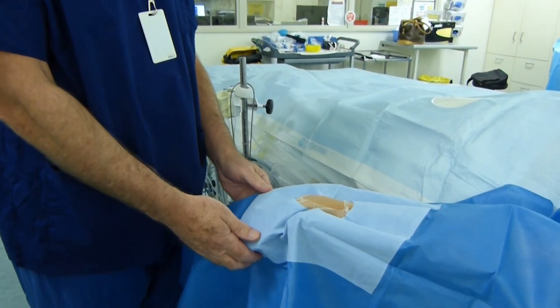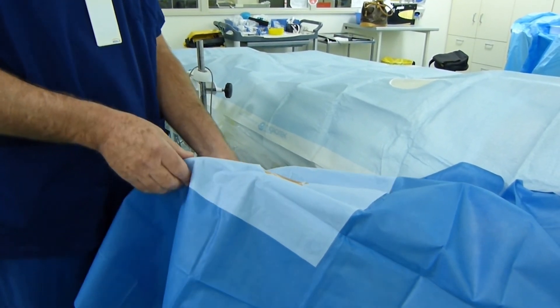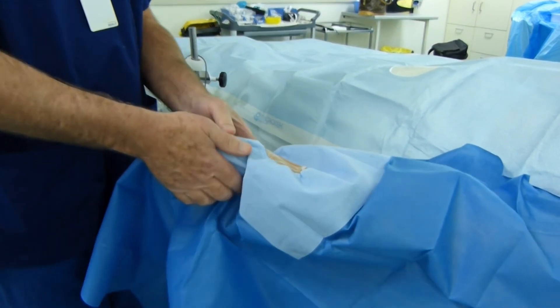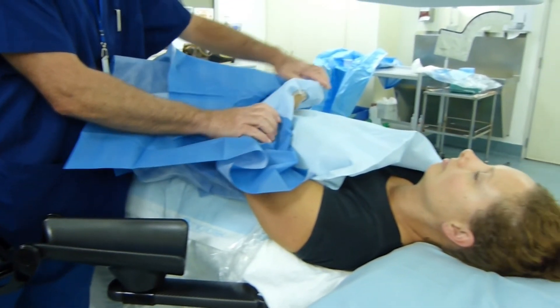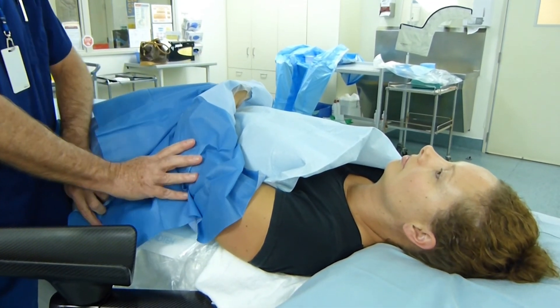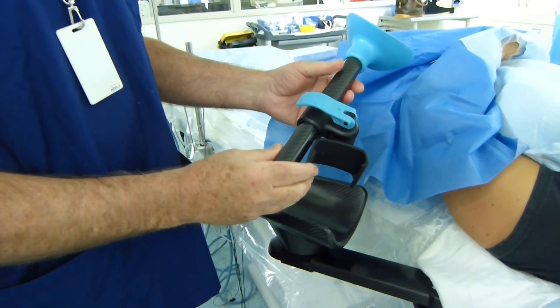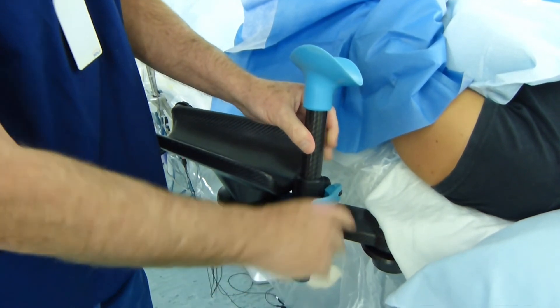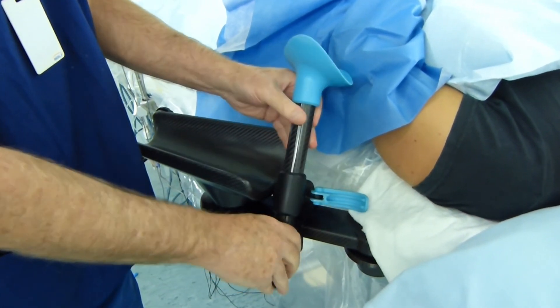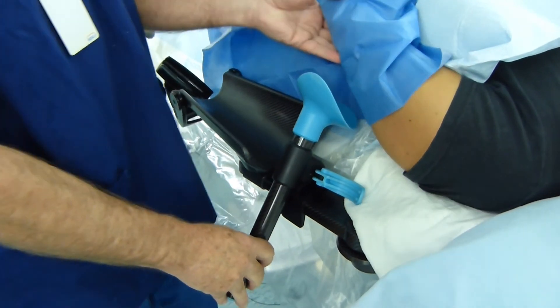Once radial artery access is obtained, the hyperextension is removed from the wrist, the handle turned medially, and then the hand is removed from the handle and the entire arm with the accompanying drape positioned over the lower abdomen. The arm support is then positioned into place and can be adjusted to optimum position to allow optimum comfort for the patient and working position for the operator.